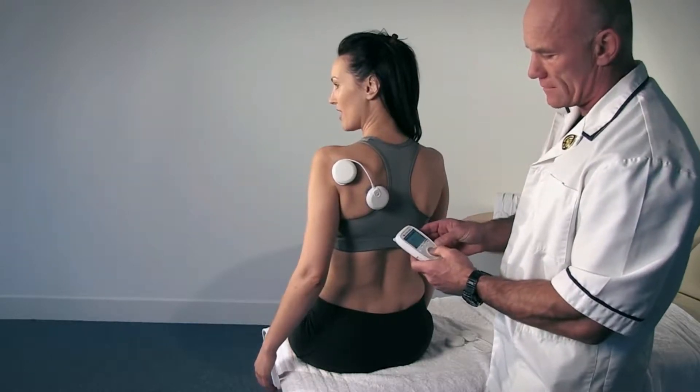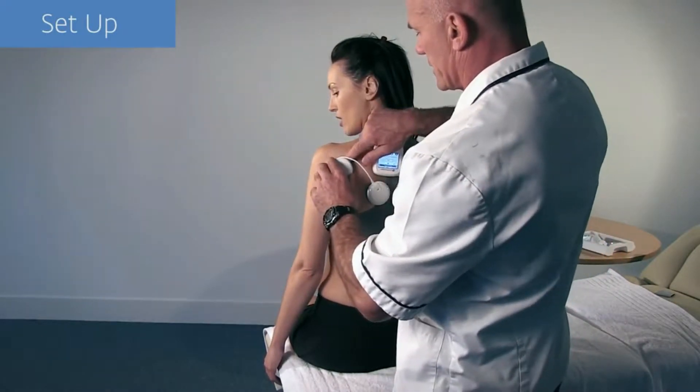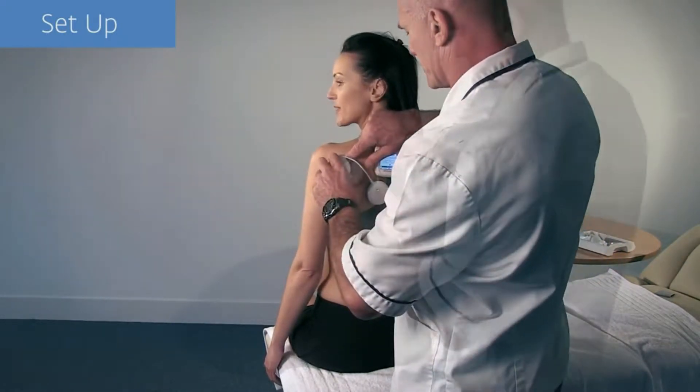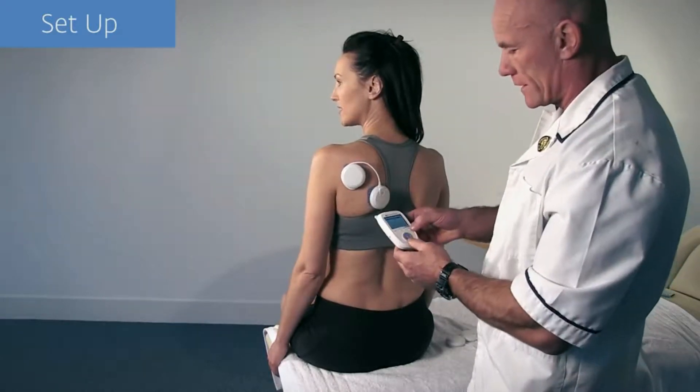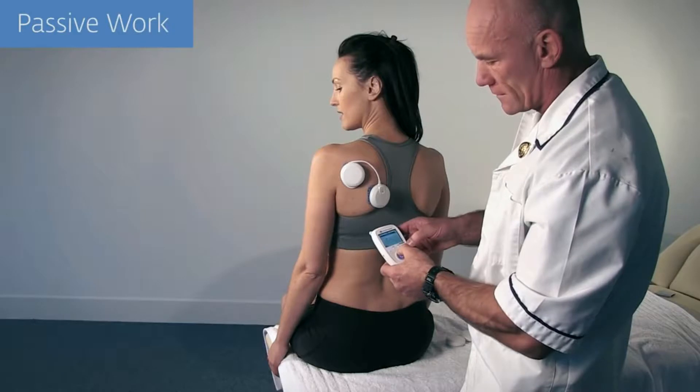In this example, we are looking to work the shoulder's external rotators. However, we see that we are getting shoulder extension instead. Simply pausing the Wireless Professional and repositioning the electrodes results in our desired outcome.